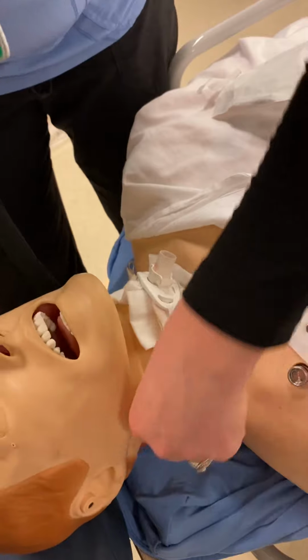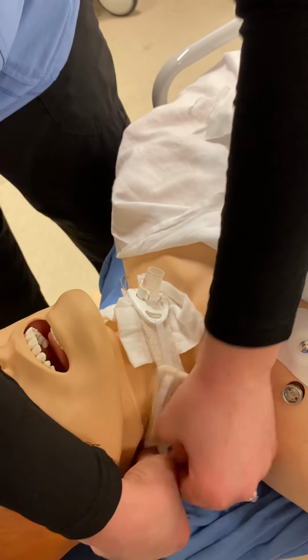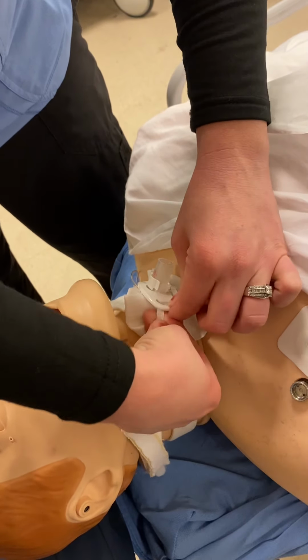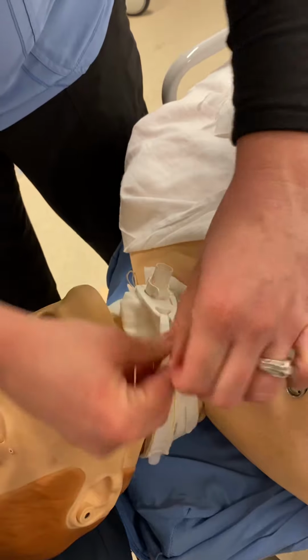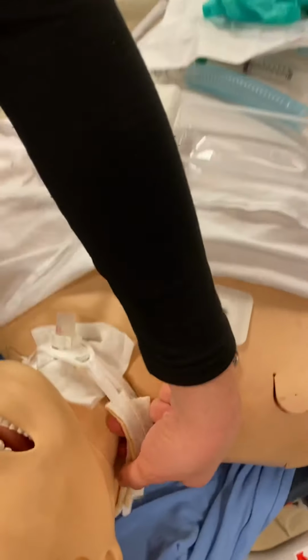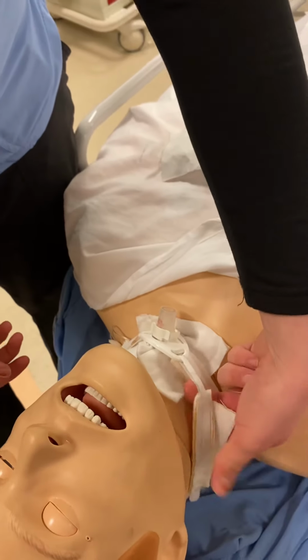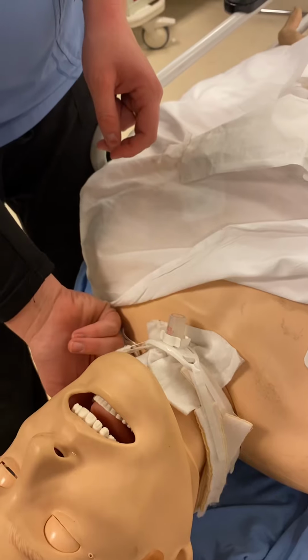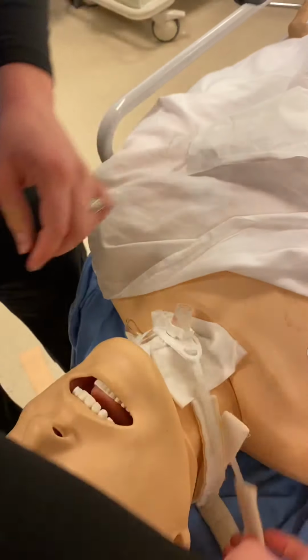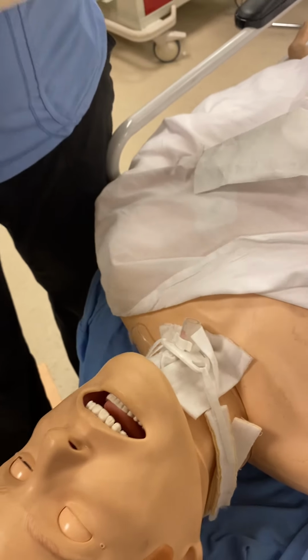So you're going to come around the neck, and then you're just going to grab the other side, thread it through so that it's nice and secure before you remove the old one. So you'll put that on, making sure that there's at least 2 finger widths. It doesn't have to be tight, it just needs to be secure. But you want at least 2 finger widths between the patient and the new trach tie. Then you're going to remove the old ones. And that's how you do trach care.